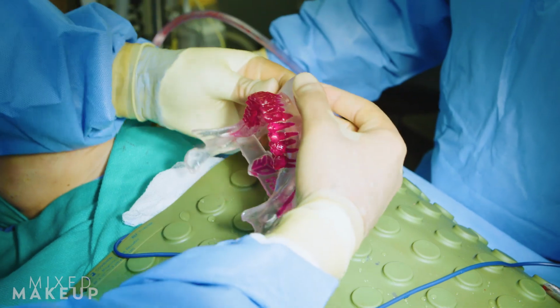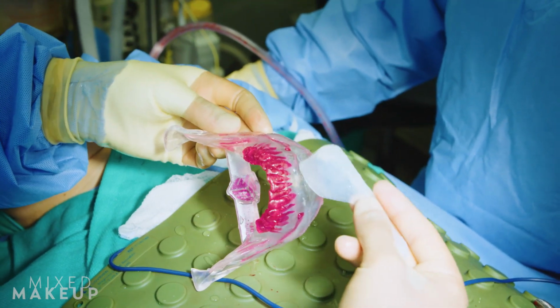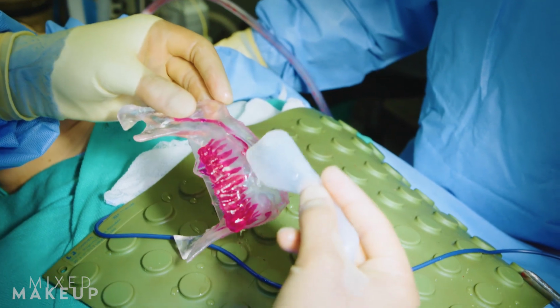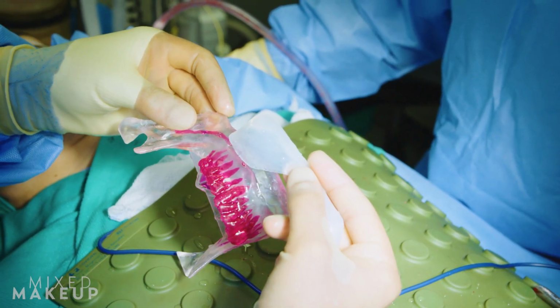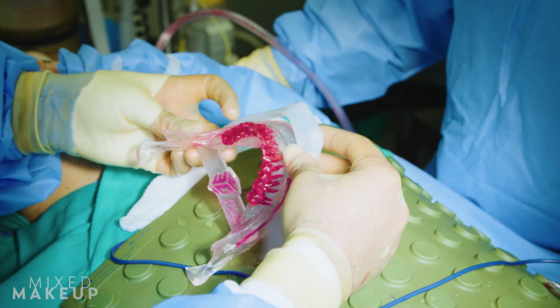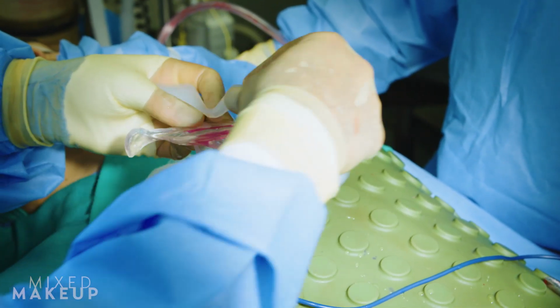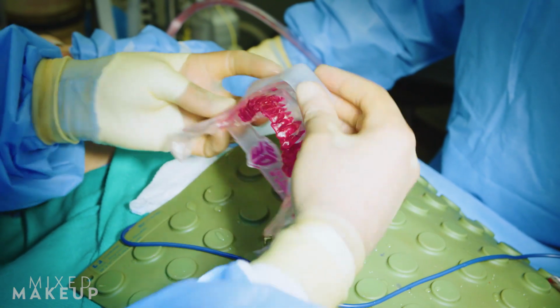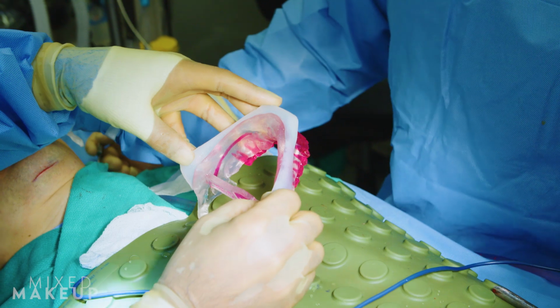One of the ways we need to start it is that we can't, unfortunately, put it through just the chin implant because this thing is so much larger than the distance I have for this nerve. If this distance was very far and it could fit in safely, I would do it as one piece this way and this way to fit in. But since I can't, we're gonna have to go backwards, and I'm gonna have to bring this thinner portion in, so we do have to cut it in half. So we're gonna cut the implant in an agreeable place so that I know where it is.